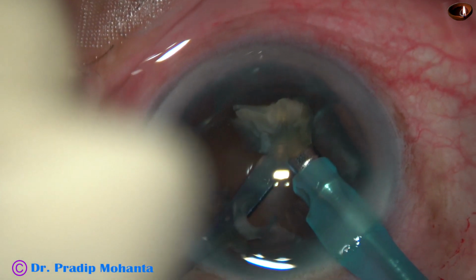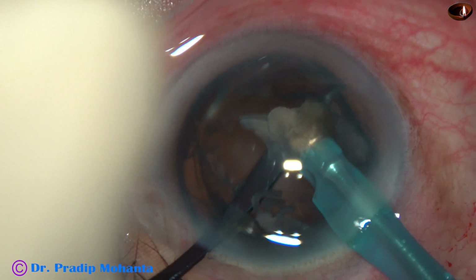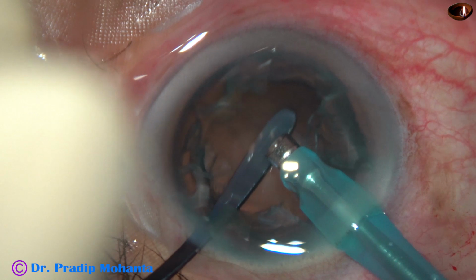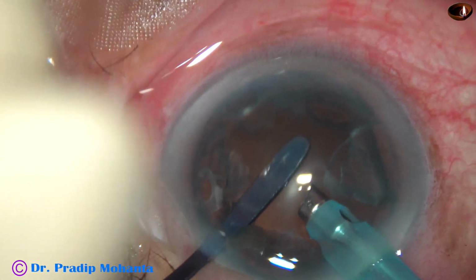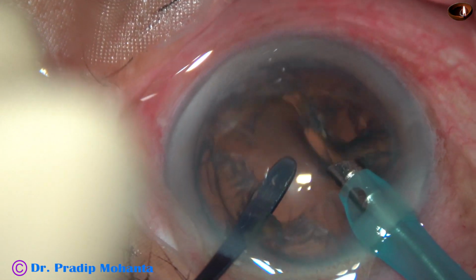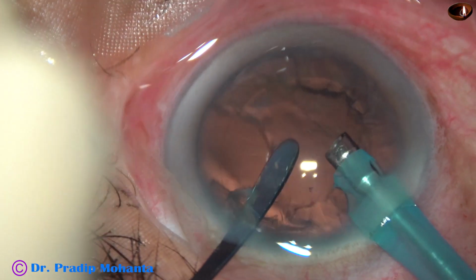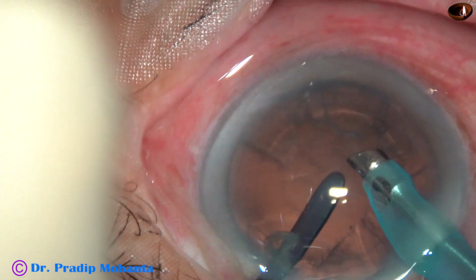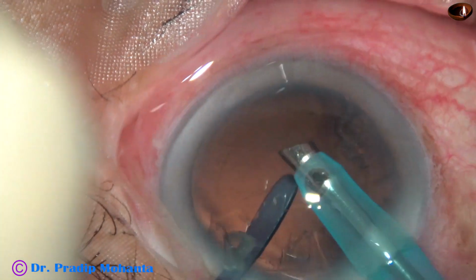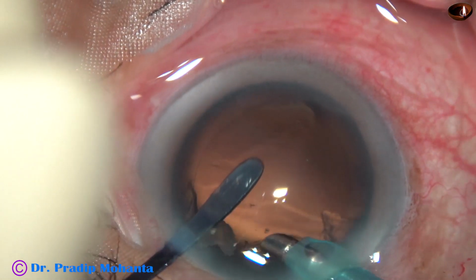And now the last piece is emulsified as the posterior capsular protector is placed just over the posterior capsule and epinuclear sheet, and as the nucleus has been removed, the epinucleus is removed and the posterior capsular protector goes behind the epinuclear sheet and protects the posterior capsule. You can even remove some cortical matter as the PCP protects the posterior capsule.